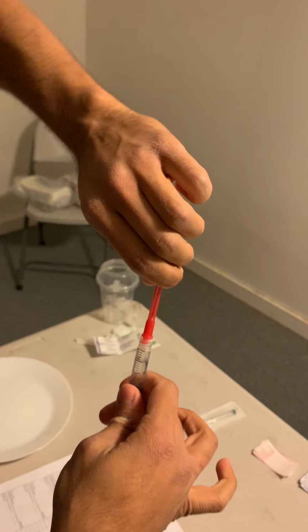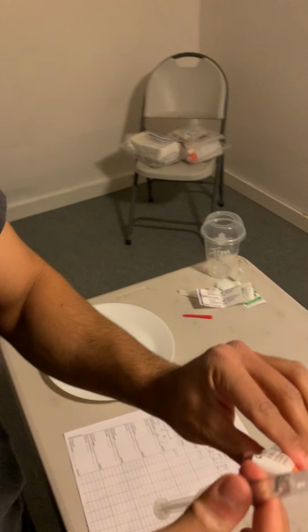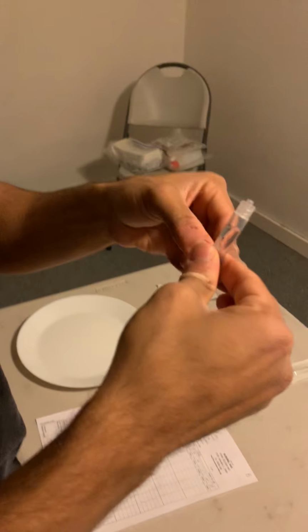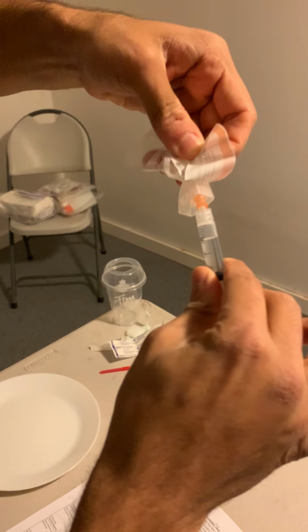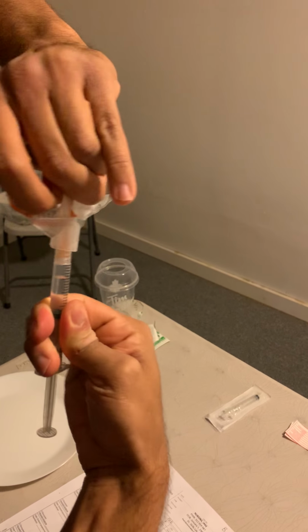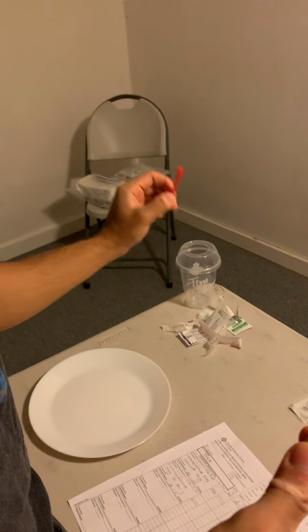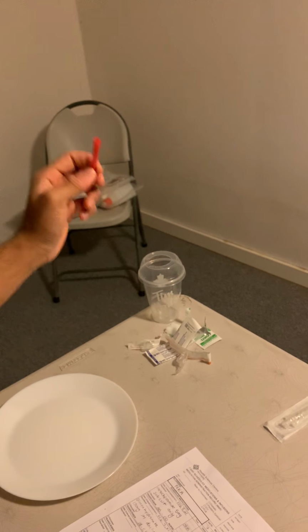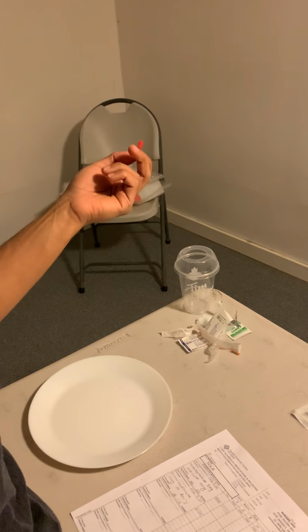I'm going to be transferring this to my needle, locking that on. Discarding that blunt fill, which does go into a sharps container, where it obviously can't hurt anybody. I will be disposing of that into the sharps container.